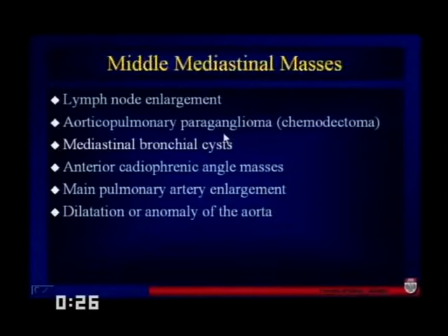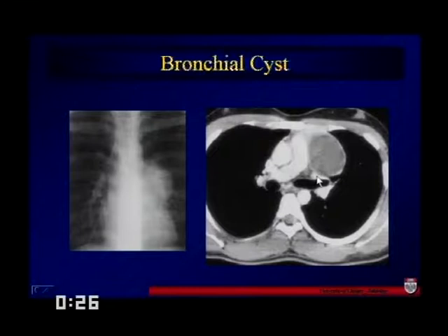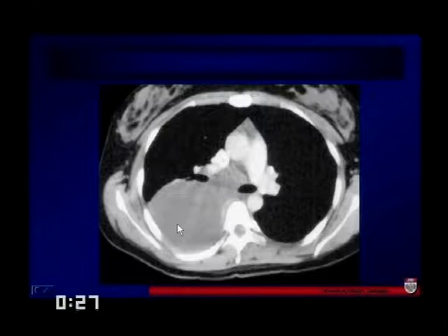Middle mediastinal masses also include bronchial cysts. This is a large bronchial cyst, which can have many different locations. Here we see one in the prevascular region, almost as if arising from the AP window. We can see them almost anywhere contiguous with the mediastinum — here is another large bronchial cyst contiguous with the subcarinal area. The most common region for a bronchial cyst is going to be the subcarinal area.